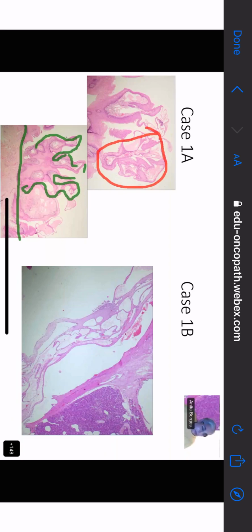Anybody else? Come on now, one by one. That was Dia. So, Limpy, do you think Dia is right when she called this a papilla? You just have to answer yes or no. Yeah, Limpy, are you there? If you don't answer immediately, I don't know whether you are there or not. Hello, ma'am. Suveta? Hello, ma'am. Yes, ma'am. Suveta.